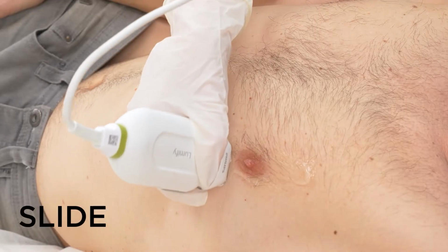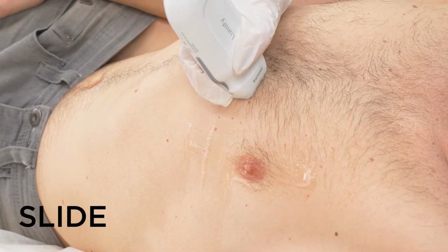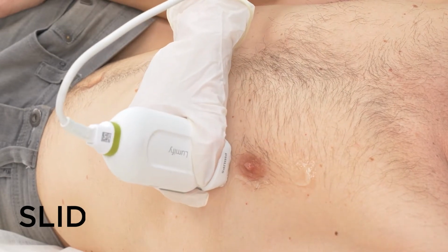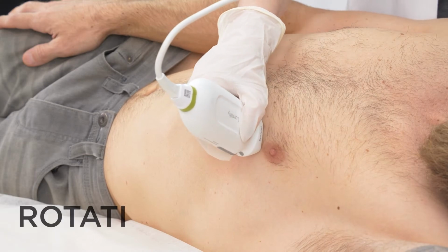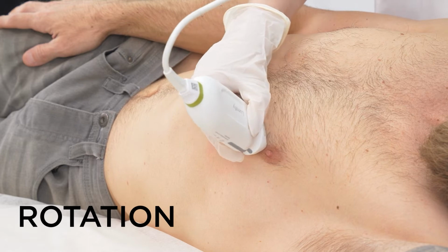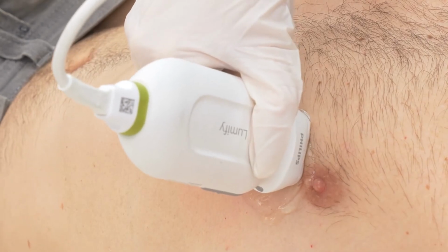Slide: sliding the ultrasound probe on the patient's body, up, down, right, or left, while keeping its position at a vertical angle relative to the patient's body. Rotation: rotating the probe around its long axis, both clockwise or counterclockwise, while keeping the probe on the patient's body.